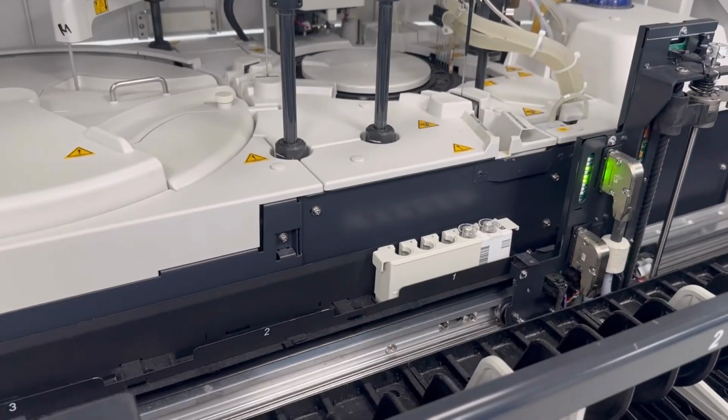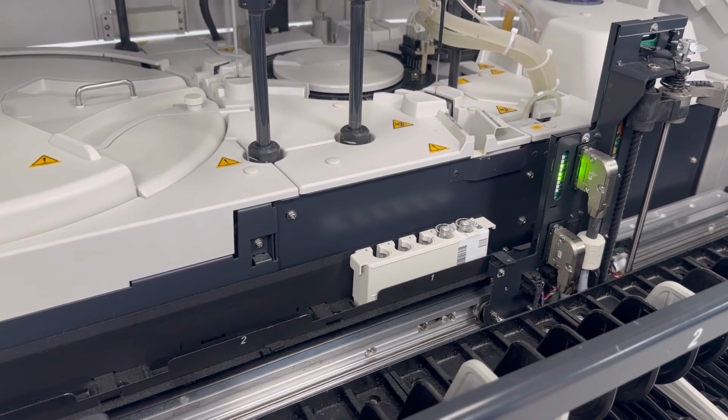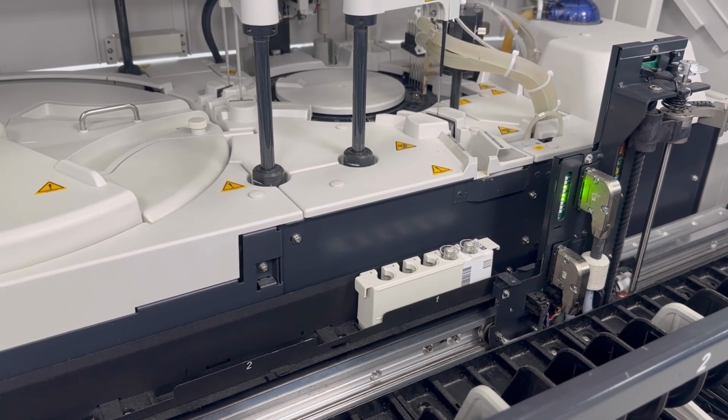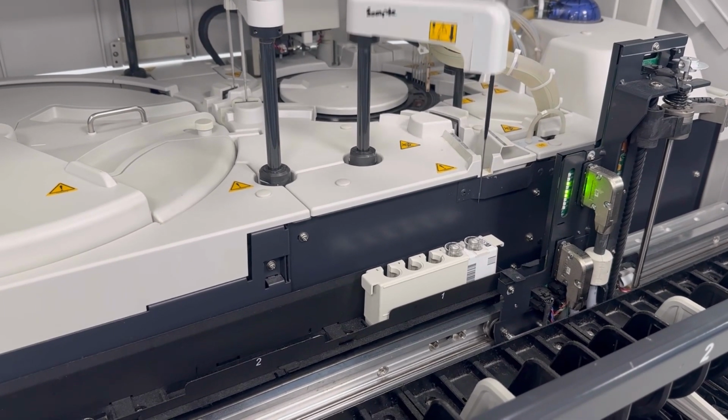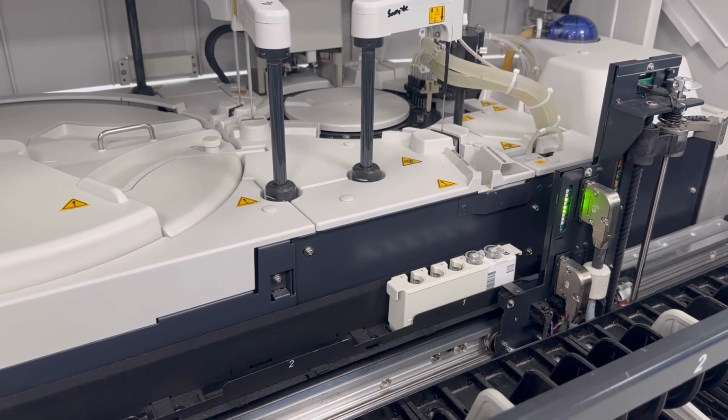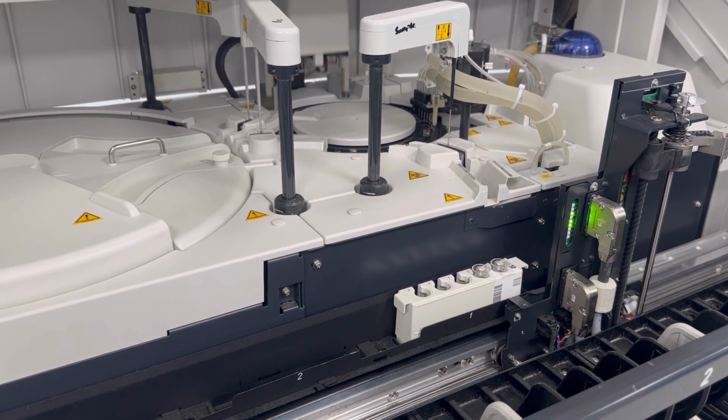Okay friends, so it will take a few minutes for all the arrangements. The machine will arrange it by itself. If it wants sample or R1 reagent or R2 reagent, it will take it. And this is how the process will begin.